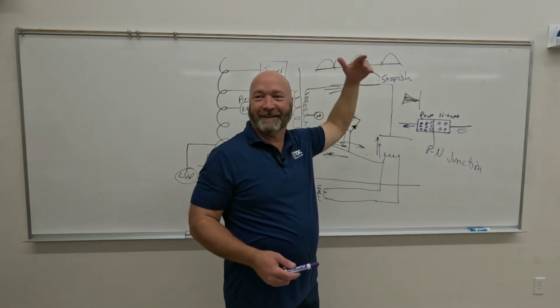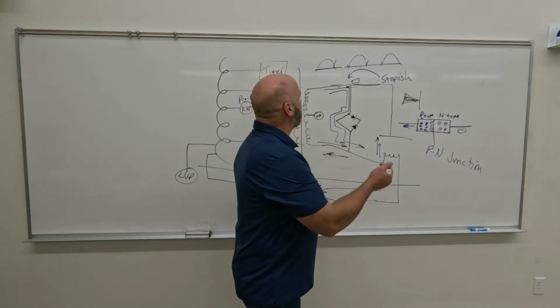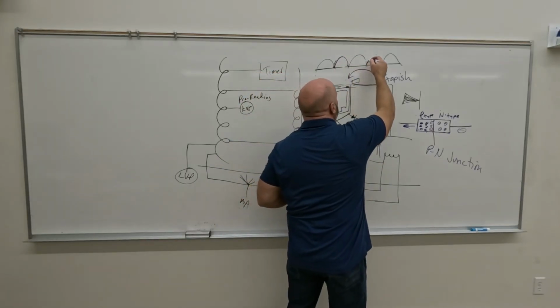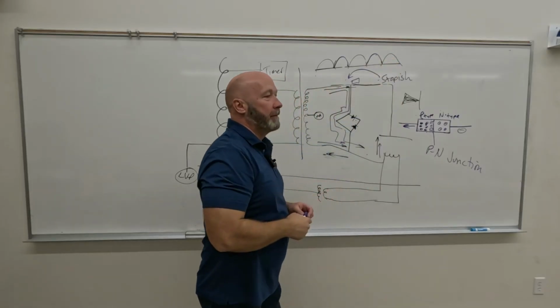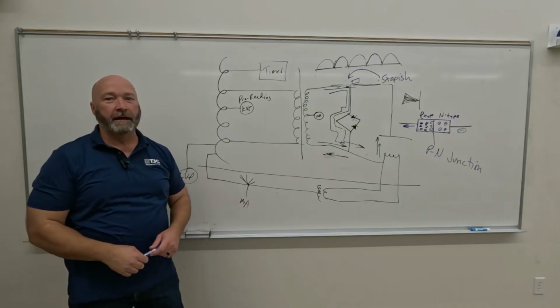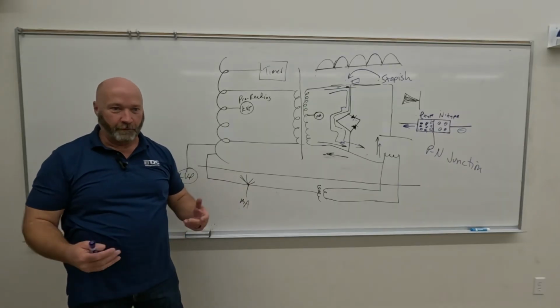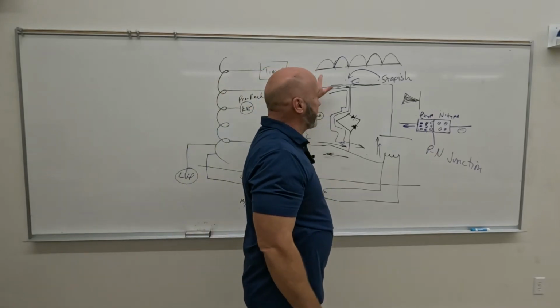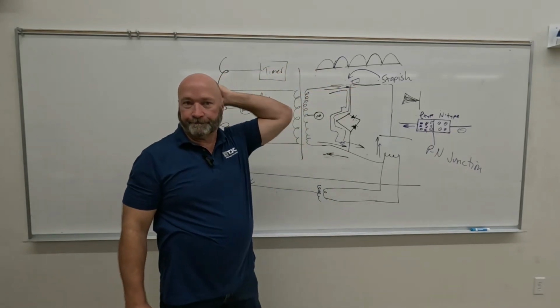Oh, wow, shocking. Okay, but if we rectify it and we invert the negative side, how much of the wave are we using now? So we're going to call that full wave rectified, right? So any single phase machine that you're going to use is going to be full wave rectified.